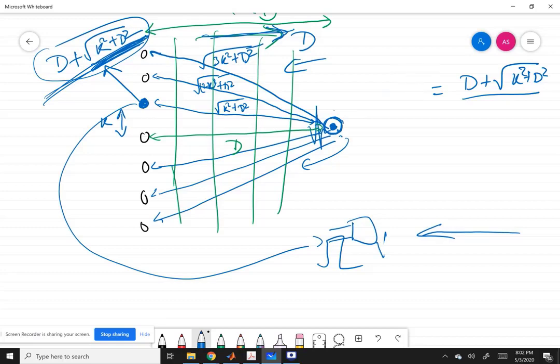So suppose this is the time it takes. Time of flight will be given by distance divided by speed of sound, which can be different in different materials, and that will give you the time of flight.